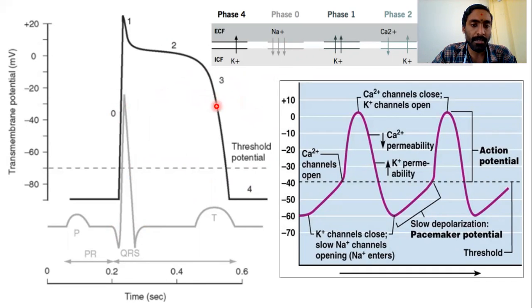So what are the implications we draw? If I have a drug that blocks the sodium channel, the QRS is going to widen, like in tricyclic antidepressant poisoning or patients on sodium channel blockers. The importance of phase 2 is that hypocalcemia correlates here with the ST segment, and prolongation of the ST segment is going to be because of hypocalcemia. If I have a potassium imbalance, I will affect phases 2, 3, as well as 4. Hence, I will affect both my ST segment as well as the T wave.